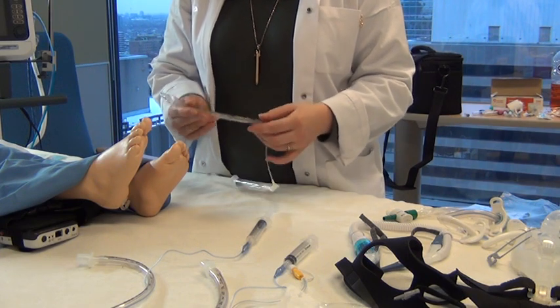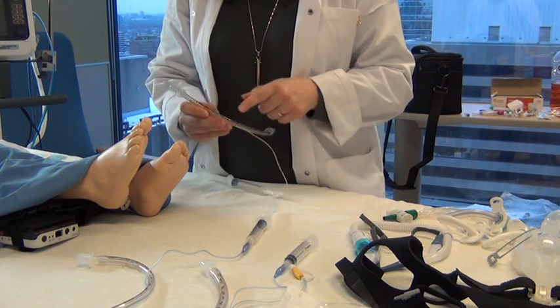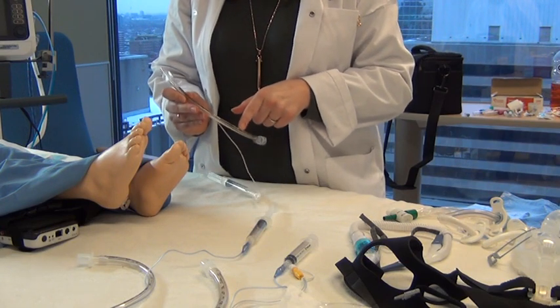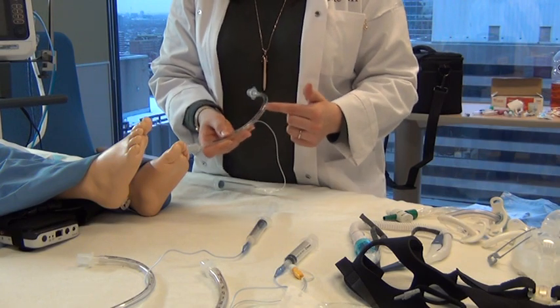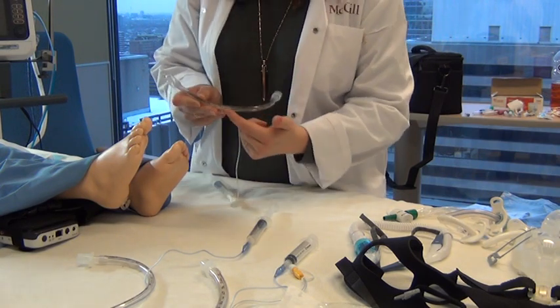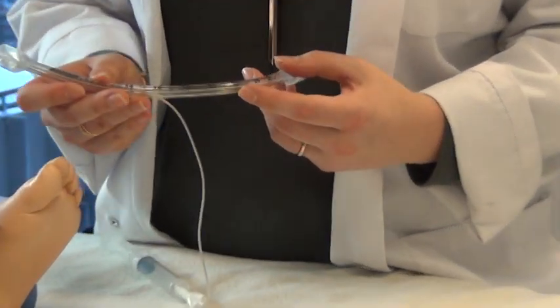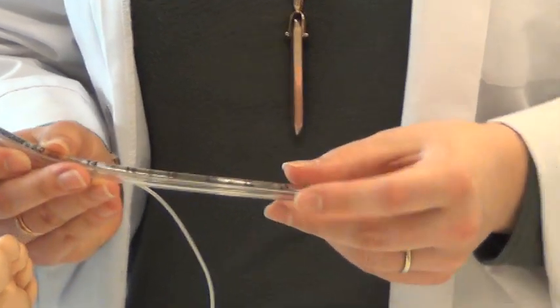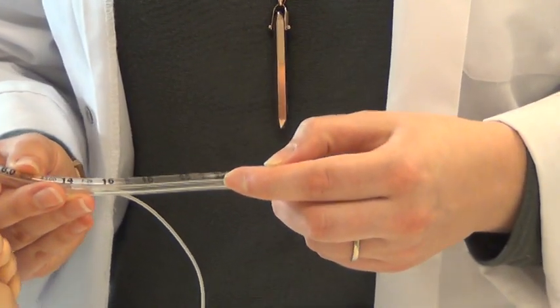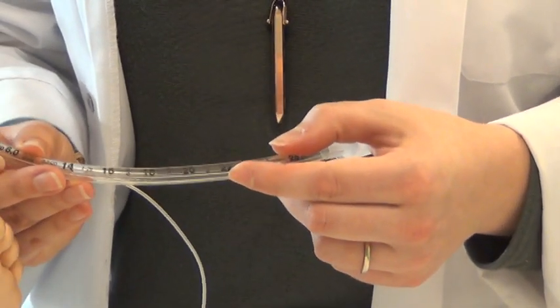So one of the things when it comes to nursing care, when you do your assessment, is actually looking at the size of the tube, but also looking at the placement of the tube. So essentially, when the tube is inserted, it will be pushed into a certain amount of centimeters that are indicated here on the tube. And this is an assessment that you want to be doing to ensure that when you did your initial assessment, when you came in at the beginning of your shift, if you were at 22 centimeters, as you progress through the day, you want to ensure that it stays at 22 centimeters.